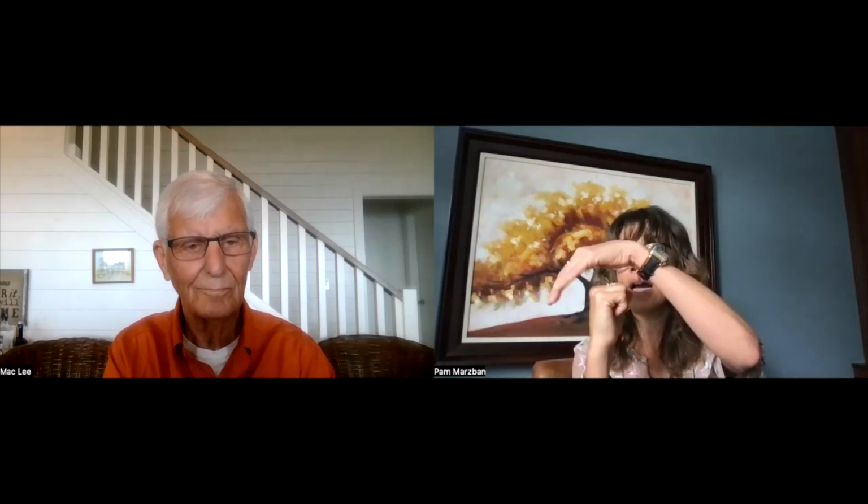Is the right side sticking out this way and the left side in? I'm trying to see where that space is so that I can create an orthotic that gives you that nice concentric or even space around the ball so the disc can pop back on and now the joint can glide when you talk or when you chew. So that's how I use CBCT imaging to verify my joint position.